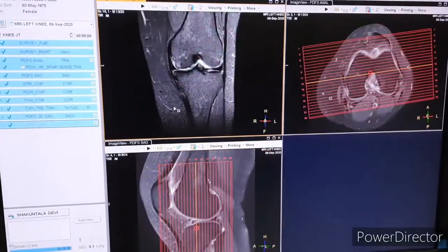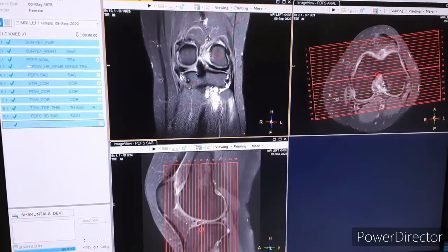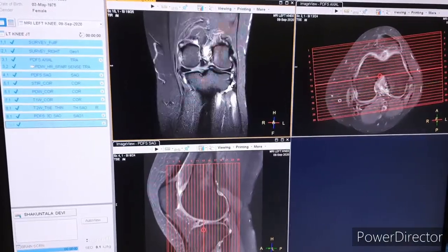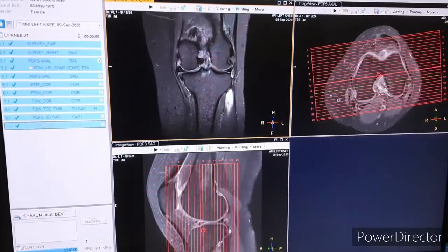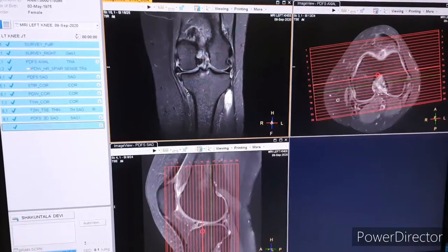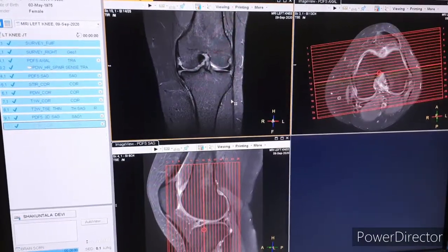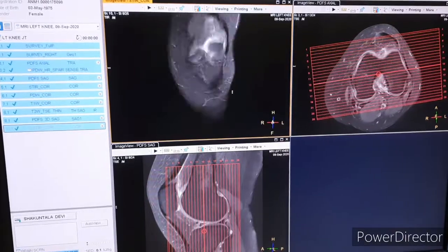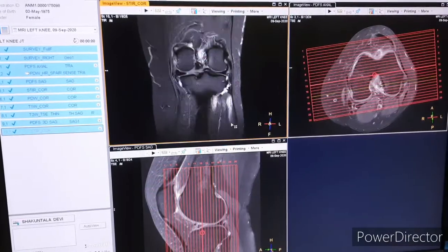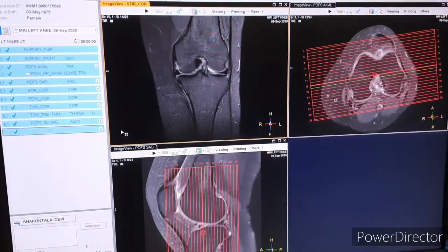The last sequence is a repeated one — we have taken it for this lesion, or you can say this cyst. Sometimes you have to cover according to the region of interest. Whenever you see a lesion or area of interest, you can change your FOV. In that case we have extended the scan area till the one third of the knee. So this is the planning and protocol of MRI knee joint.